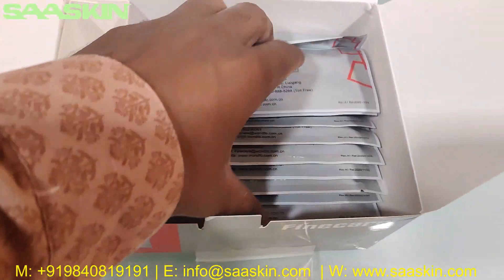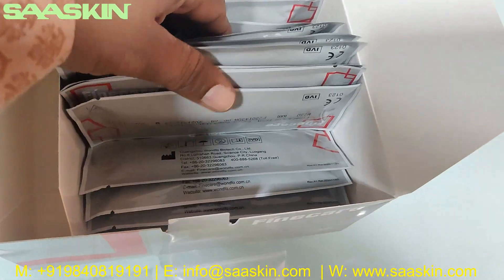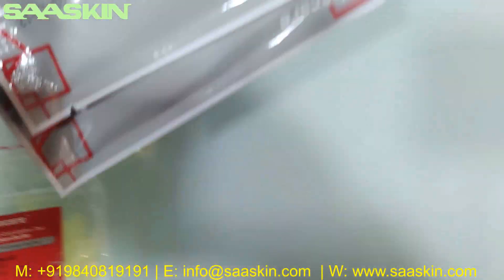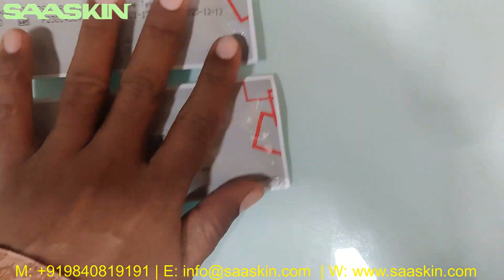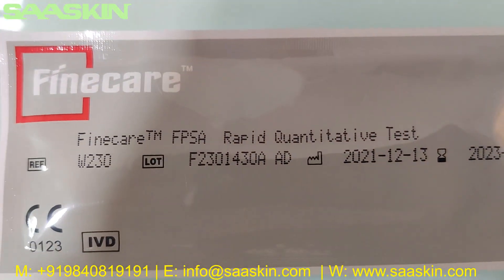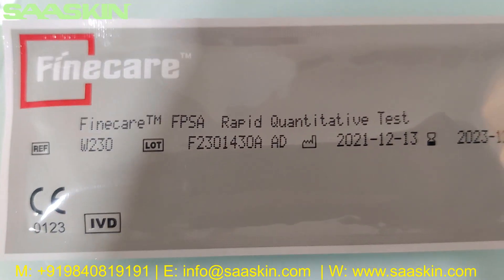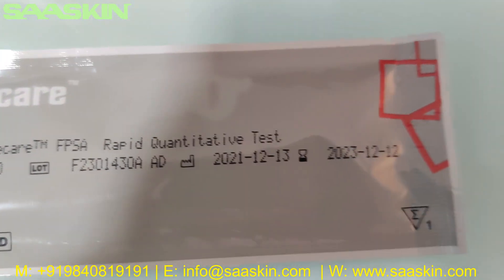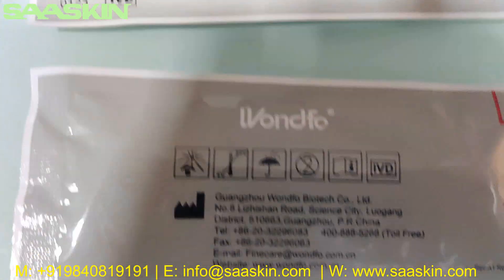And inside you can see the 25 test cartridges. Here is a test cartridge. This is the FineCare FPSA Rapid Quantitative Test cartridge, with the reference number, lot number, manufacturing date, and expiry date printed on it.